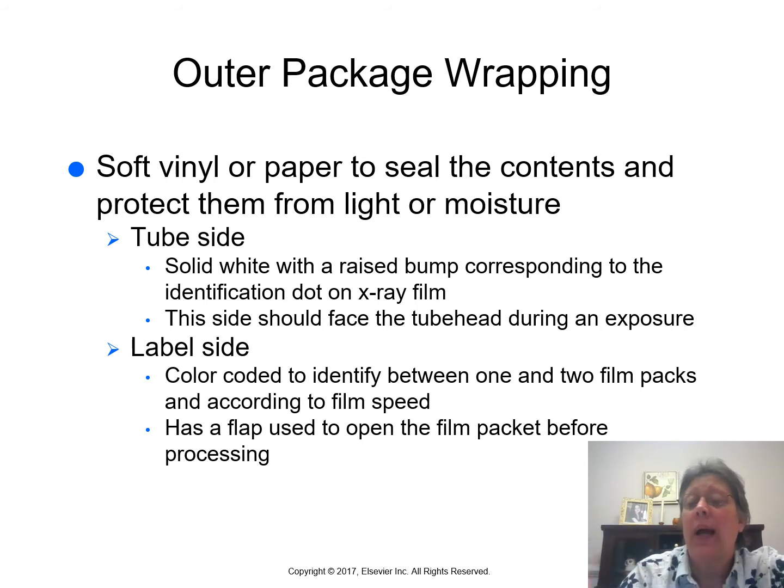It also has a little identification dot that's in one of the little corners. The identification dot is just a little bump that's on the film, and we'll learn as we go through that the identification dot will help us mount our film.